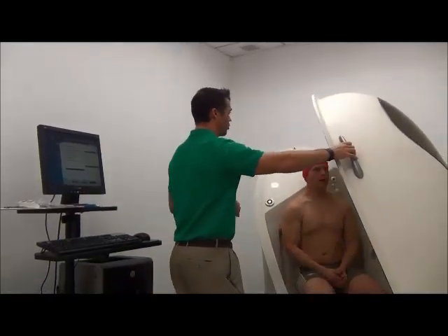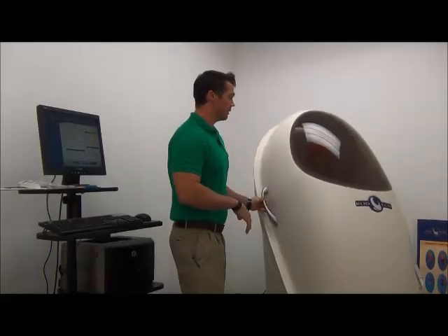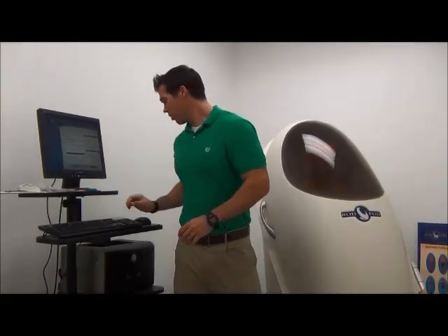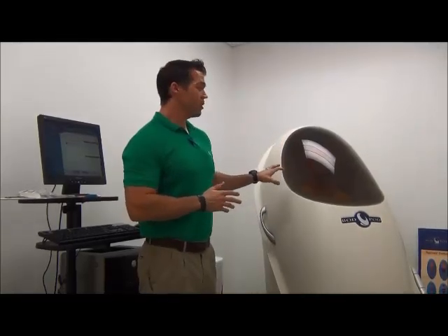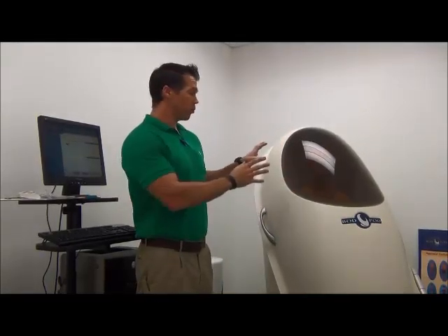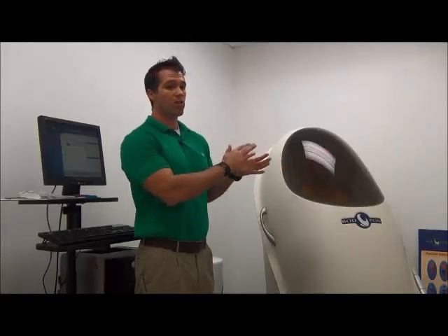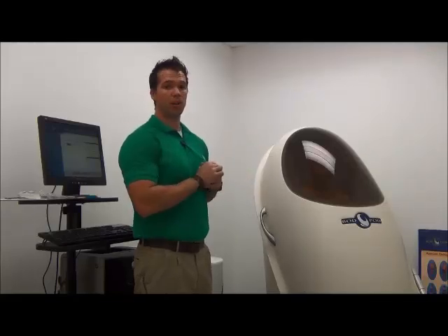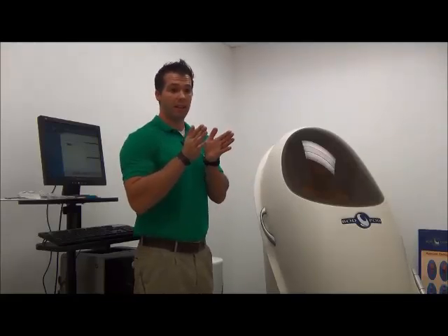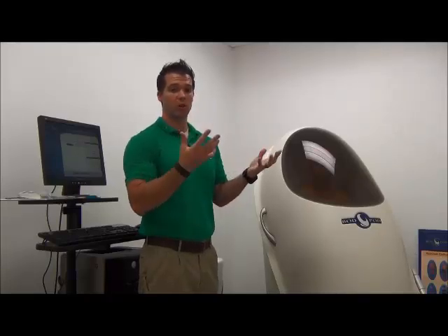We'll go ahead and have Curtis get in the machine and shut the door. We ask Curtis to stay still, breathe normally, and not fidget. The machine knew how much volume was inside before Curtis stepped in, and now that he's in, it measures the volume after he entered — so it knows how much air he displaced, and that's how we get his total volume.